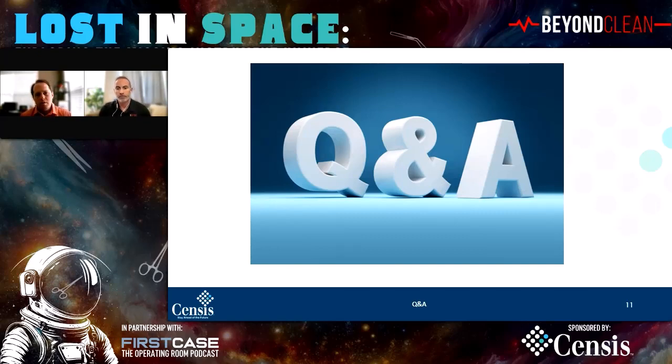Yeah, it's a good question. That was a big focus of the work we did when we were examining productivity. Like I said, there is a direct correlation between the number of instruments in a tray and how long it takes to process that tray. And so we did do a lot of work to try and figure out which trays are ripe for optimization of some kind. And how do you know? It takes a lot of calories. You burn a lot of calories to optimize a tray because you've got to work with the OR. You've got to talk to the scrub techs and figure out what does the doc use all the time? What does the doc use sometimes? What does the doc use never? And there are products out there that can help you with that, for sure.